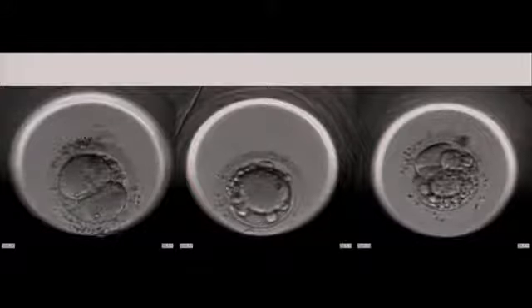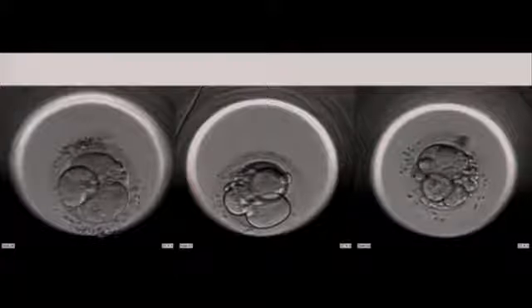So the beauty is we can compare different embryos and we can run them alongside each other. And here you have 3 embryos, and this patient had 10 embryos, for example. But if you play the video, you can see there are 3 embryos here, and we can compare their growth side by side and just see how each one grew. And you can see some do things differently from others. So the one on the left-hand side just went to the 2-cell stage now, but there's 2 others that seem like they're growing much faster. So we can look at these continually to see what's happening with these embryos and make decisions about what they did during different stages.